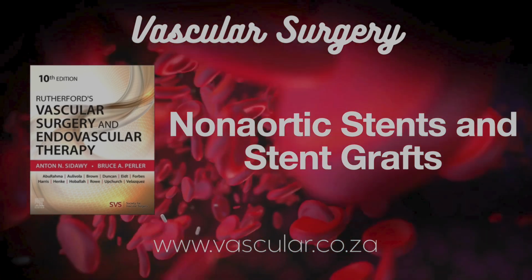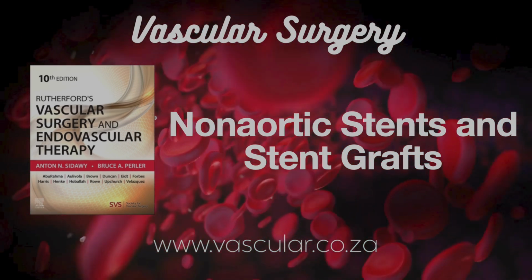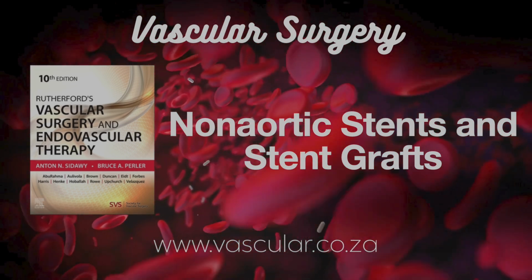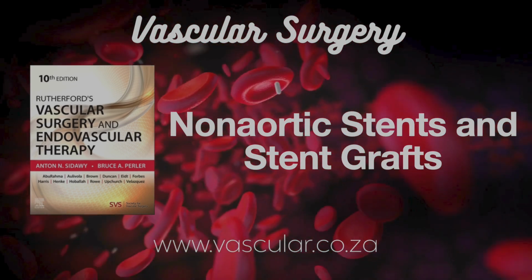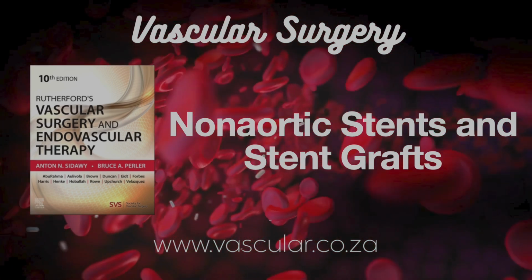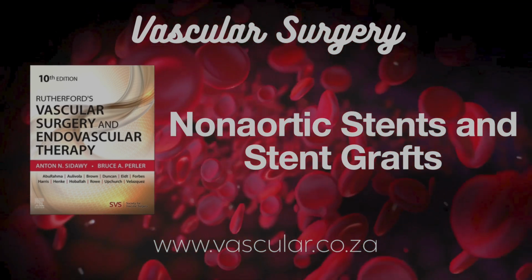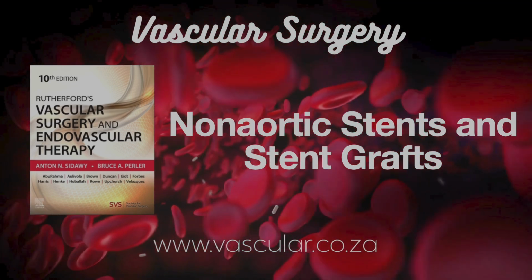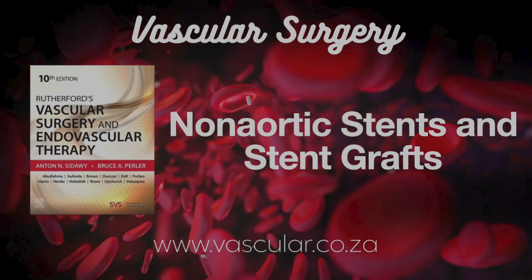The last selection factor was branch location. What's the key point there? When a blockage is right at the opening, the ostium of a branch vessel, like the renal artery origin we mentioned, the plaque often extends back into the main artery, the aorta in this case. So you need a stent that can handle that. Exactly. A BE stent is often best here. You get the radial force and the precision to cover the plaque in the branch and maybe slightly into the aorta, ensuring you treat the whole disease segment accurately.